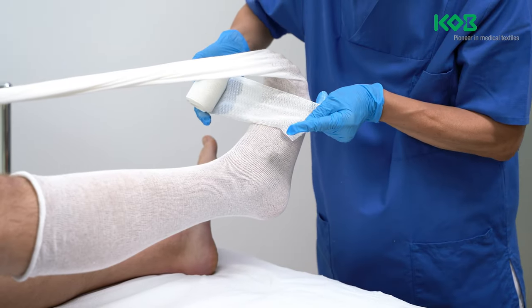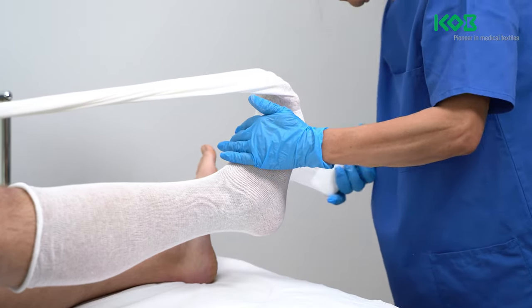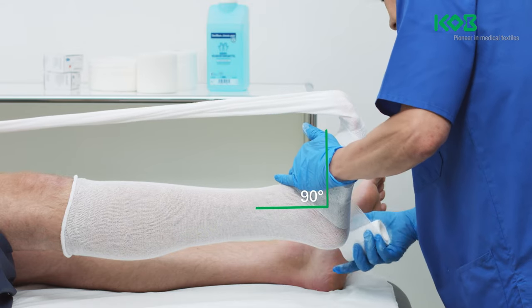Immediately after opening the package, apply the moist bandage to the metatarsophalangeal joints and wrap it around the lateral malleolus and inside of the heel. Ensure that the patient's foot is placed at an angle of 90 degrees to the lower leg.